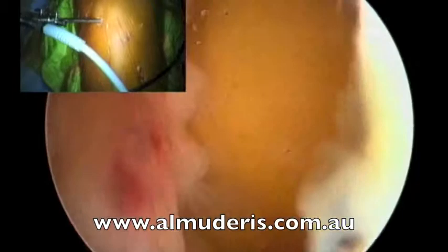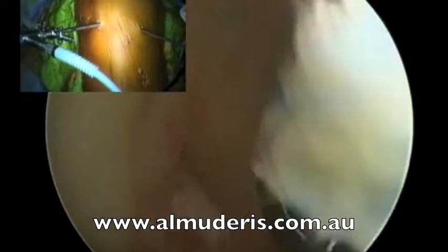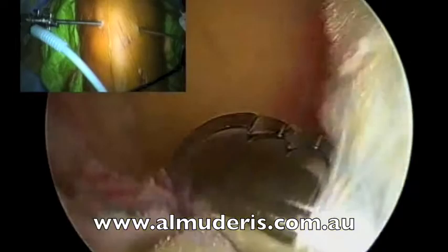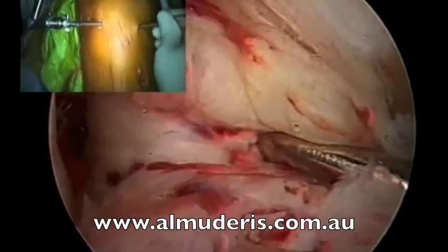This is a torn ACL clearly. As you can see, the fat pad usually is in the way. I try to clear some of it, but I preserve the ACL stump. I clear the fat around the footprint of the ACL, which is very important in my opinion, especially as a landmark for the ACL graft. Now we have a good picture.